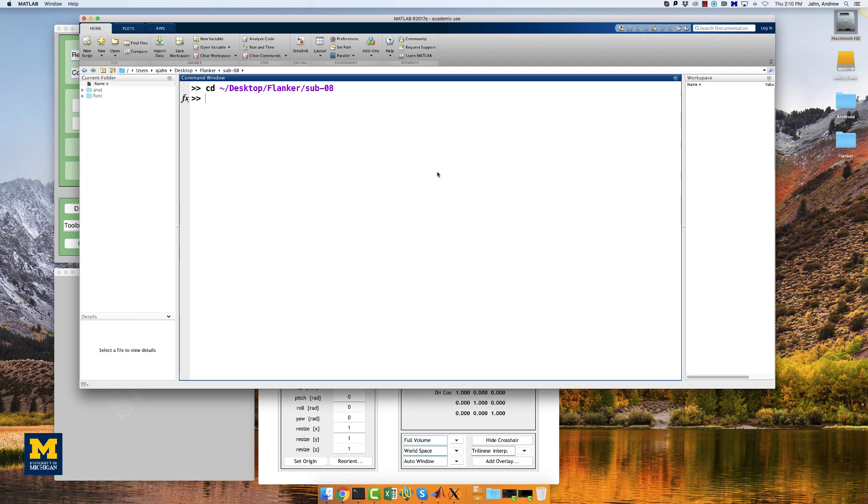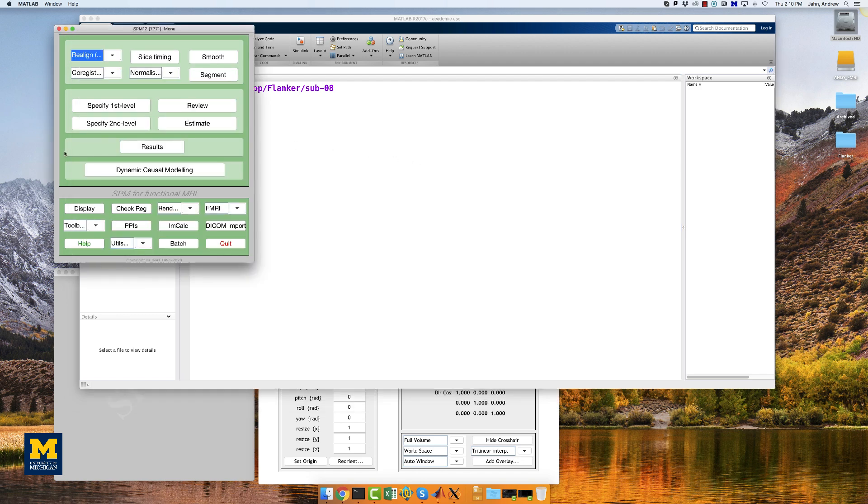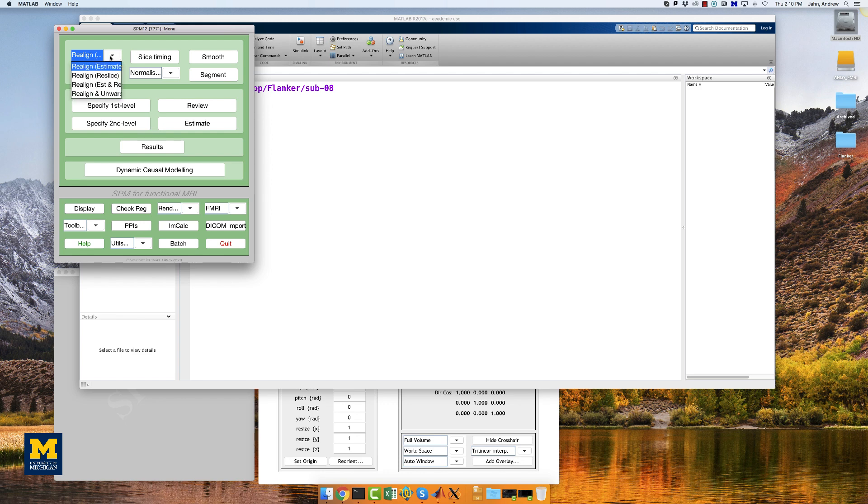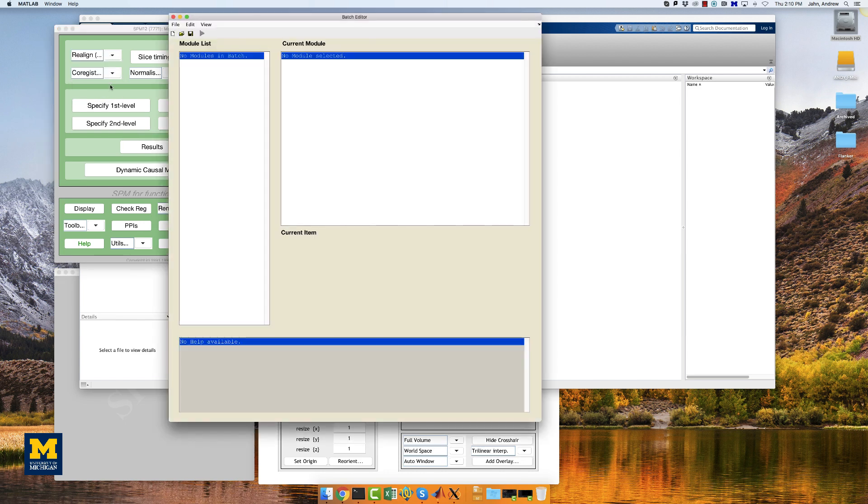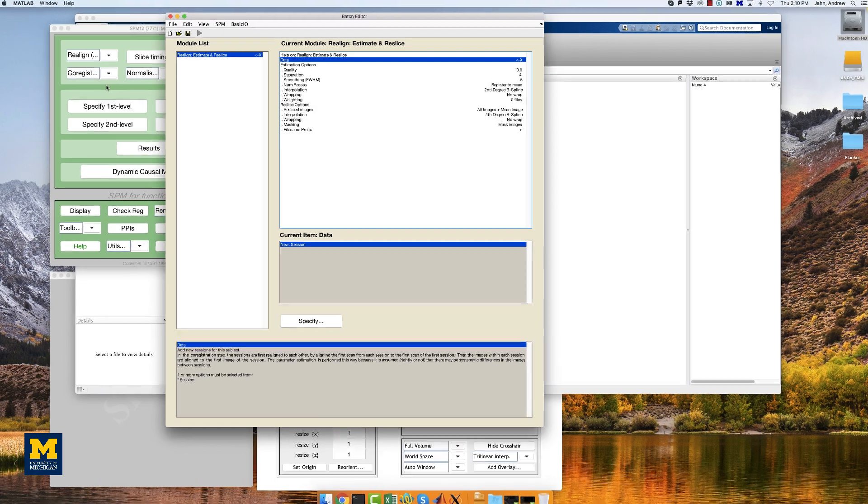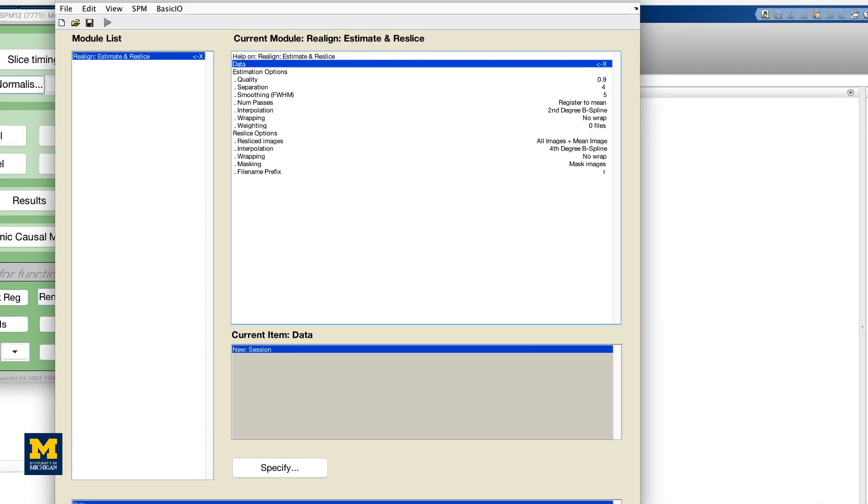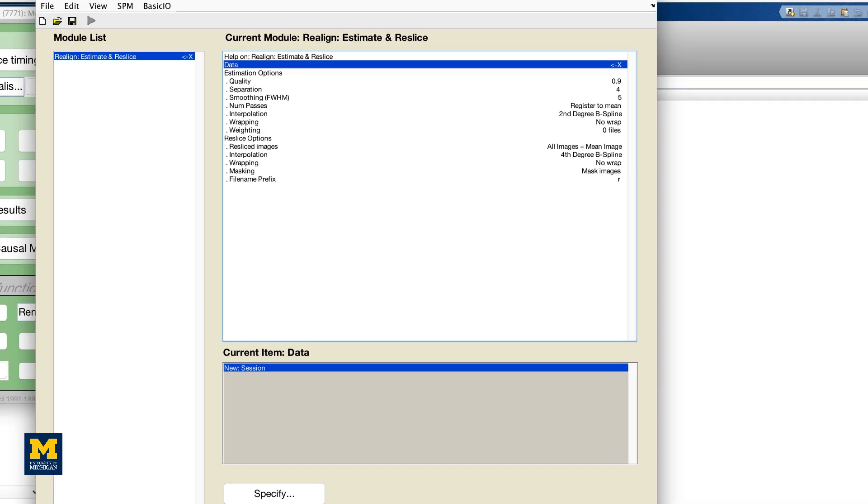Our first pre-processing step is realignment, which will align all the individual volumes together, like cards in a deck. If you click on the button Realign, Estimate, and Reslice, a window opens up showing the options for realigning and reslicing the data. The estimate part refers to estimating the amount that each volume is out of alignment with regards to a reference volume, and Reslice indicates that the estimates are used to align each volume with respect to the reference volume.